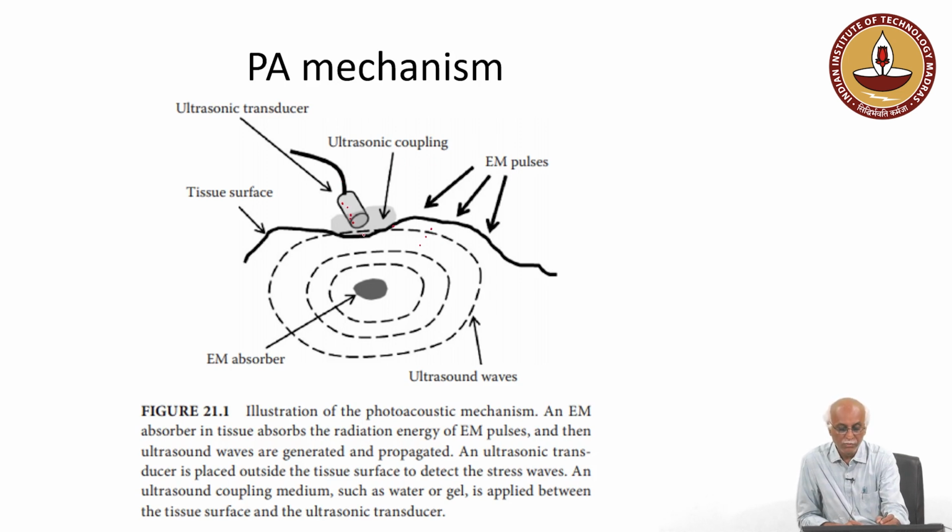So, what will it do? It will pick up this acoustic signal which is generated at some depth below the tissue surface, where the laser has interacted with the tissue and produced some temperature change. So, this is the photoacoustic mechanism for tissue interaction.